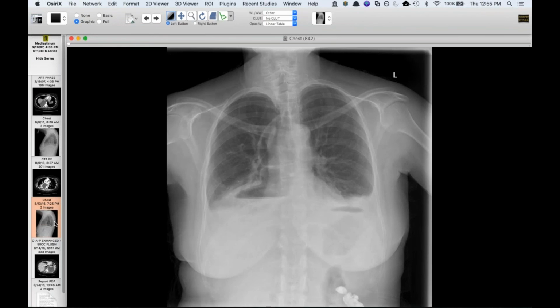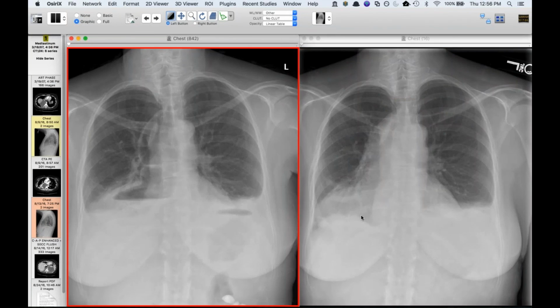So this is another radiograph I encountered when I was on call, and it's kind of peculiar because you look at this, and my first guess was that either this person had had a pull-through and an esophagectomy, or they had achalasia and had just a dilated, fluid-filled esophagus or achalasia, something. But as you'll see, it gets much more interesting than that.